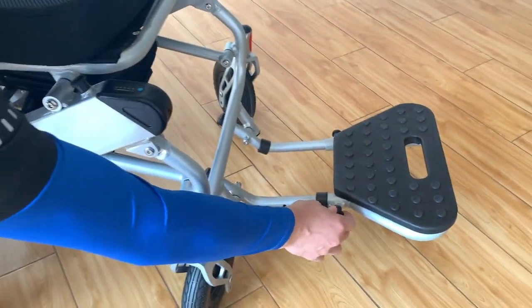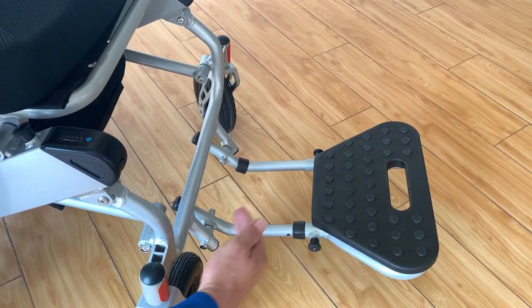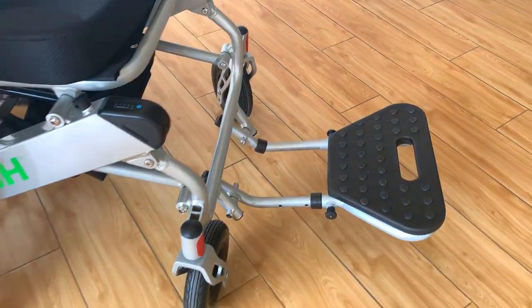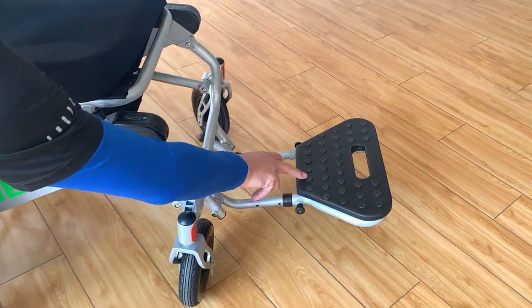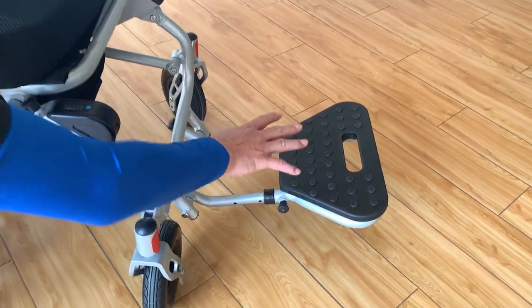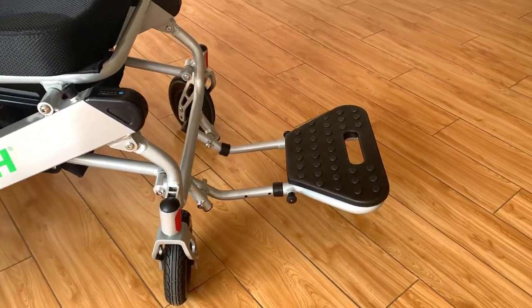The battery has the same design too — you can just push the battery out. Also, the footrest here can be adjusted for length depending on the leg length of the user. It's really simple and easy, and it also has anti-slip spots on top. These are really good features.